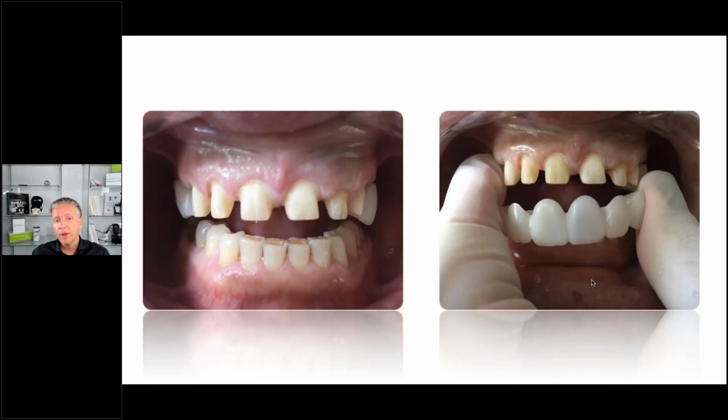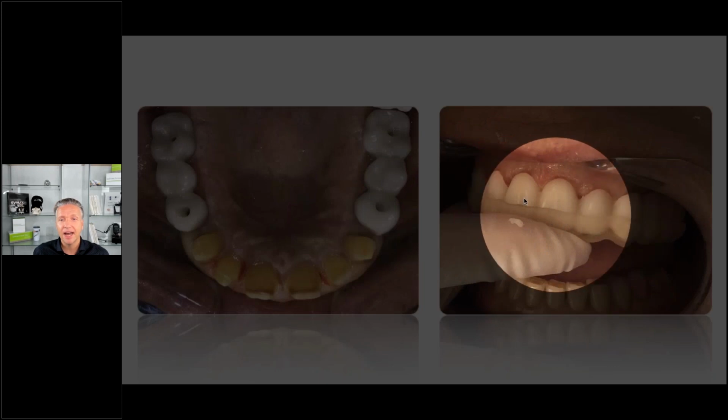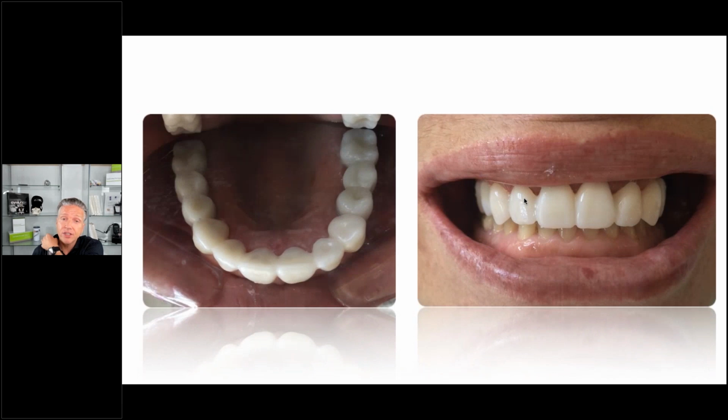On the day of seating, we go back to the patient's mouth. The doctor preps the anterior teeth and seats the posterior bridges. Remember, these are on implants, and implants don't move. So these give us the perfect relation to our planned vertical and planned occlusion. Then all the dentist has to do is retrofit the shells over the preparations, taking off the shells a little bit and the preps a little bit to make sure everything sits nice and passive. Here is a different view, and then the dentist can place the shell with the seating guide, which rests on the posterior bridges, nicely in place with full control over aesthetics, vertical, and function. Everything is seated as we planned it digitally in the computer and fabricated. So that's a very easy way to do it.